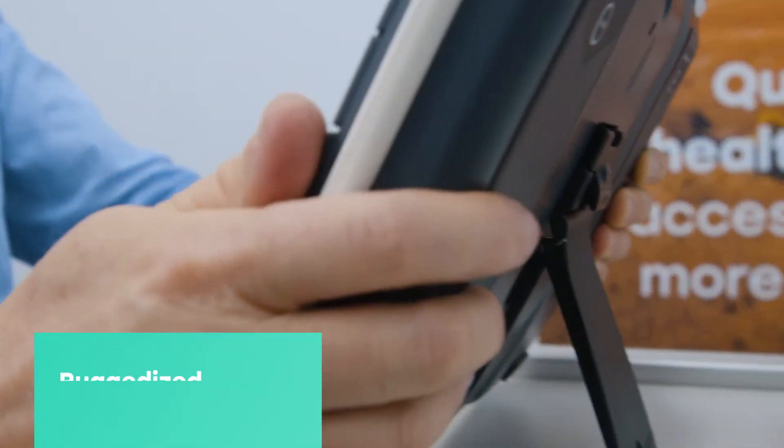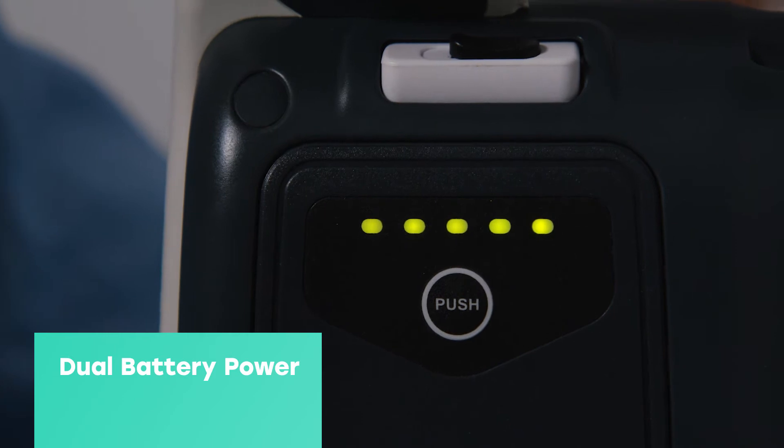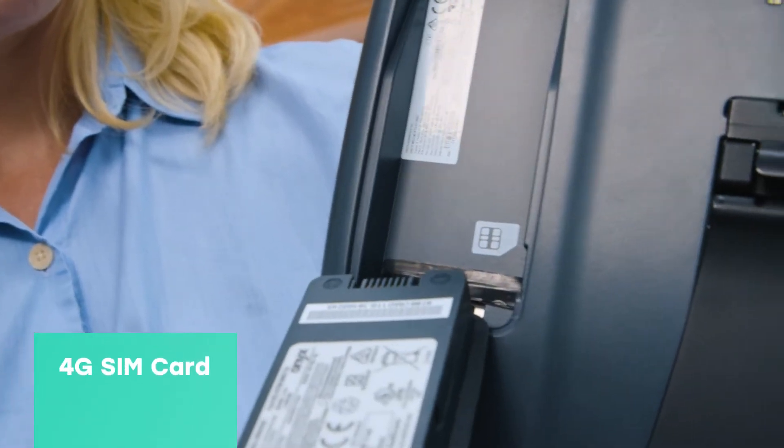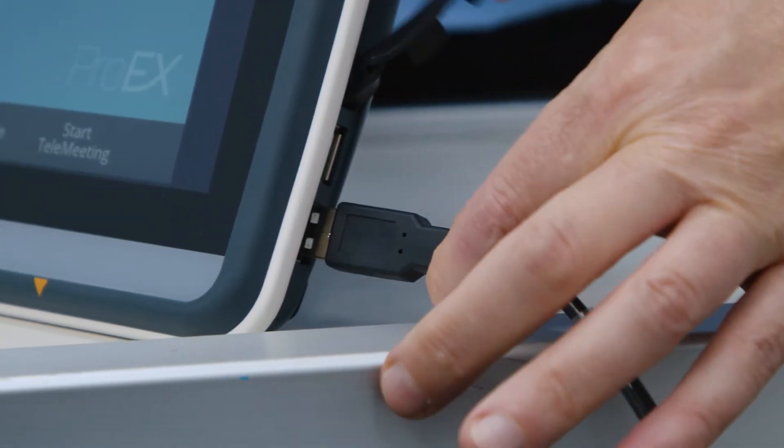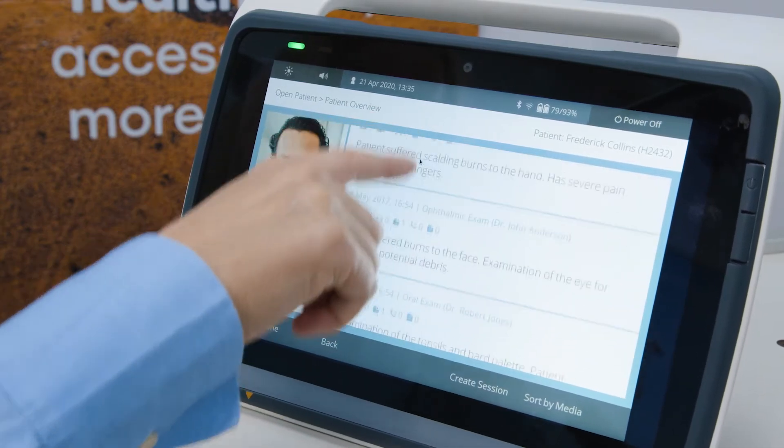The Pro EX Mobile has a ruggedized design with dual battery power and integrated 4G SIM card technology. The device is ideal for travelling health professionals with plenty of battery life for the whole day and a super bright screen.